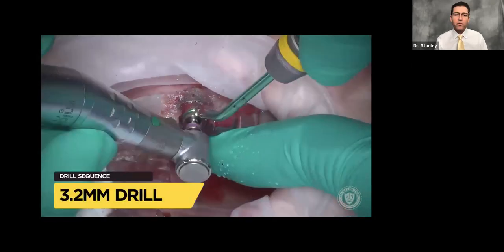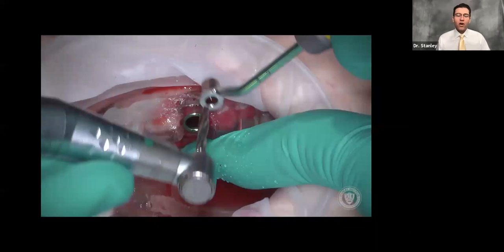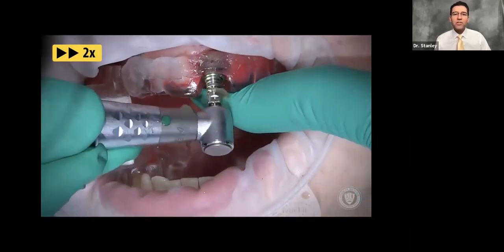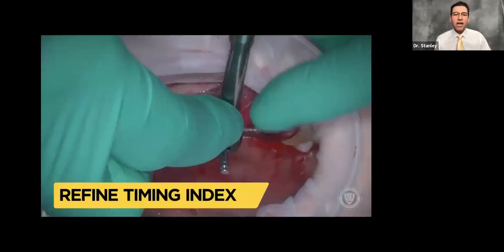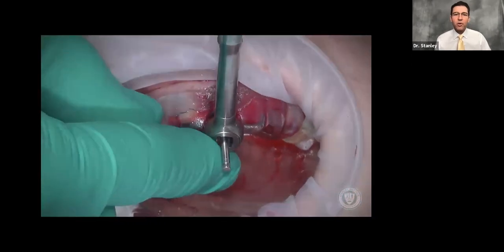This is a green implant, so the guide sleeves are green. We're stepping through, making the hole wider — we're only increasing the diameter of these drills as we step through the protocol. Now we're going to place the implant. We've turned it on to 2x speed, but as soon as that snap link touches the implant, we're down.